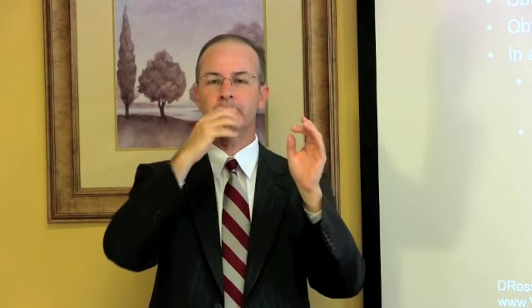And if in our patients there is progressive atrophy over the 6 or 12-month period, typically I'll recommend clinically to get another MRI every year thereafter until we stop seeing the progressive atrophy.